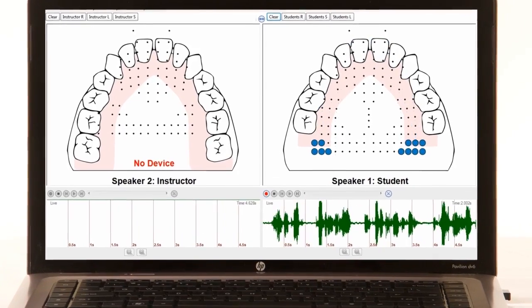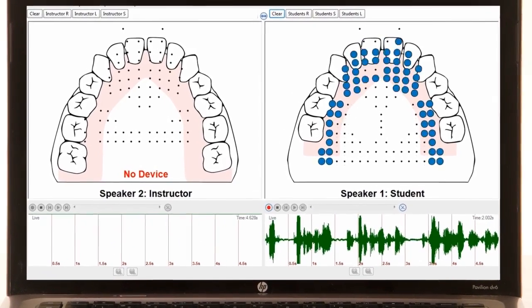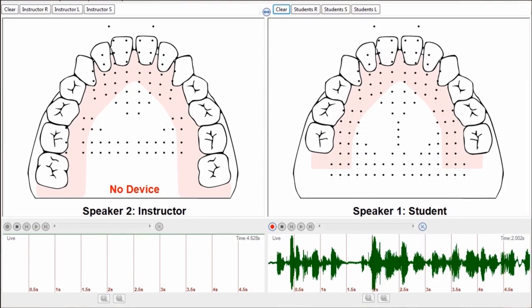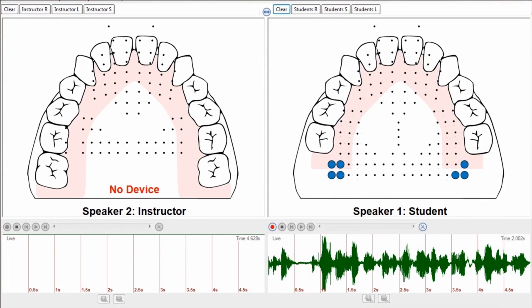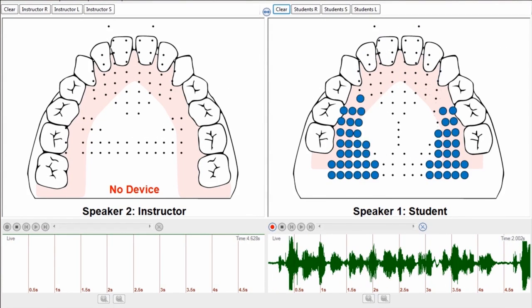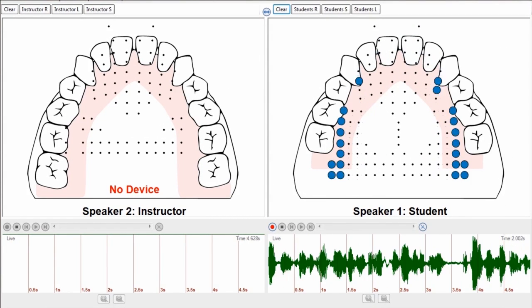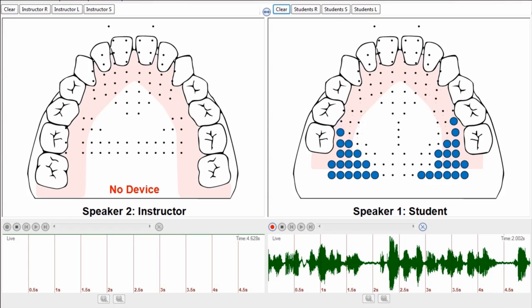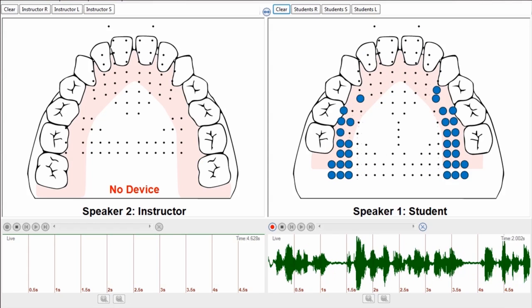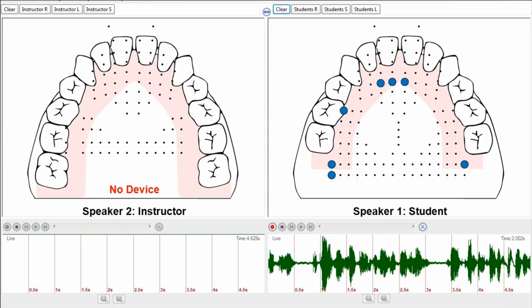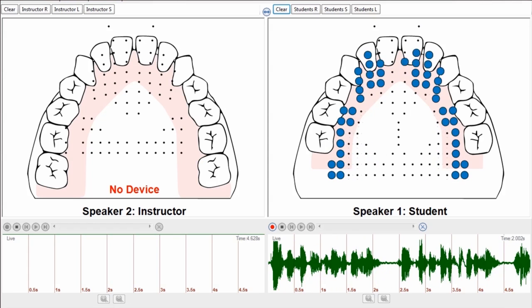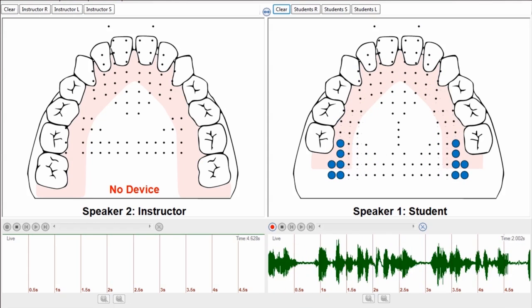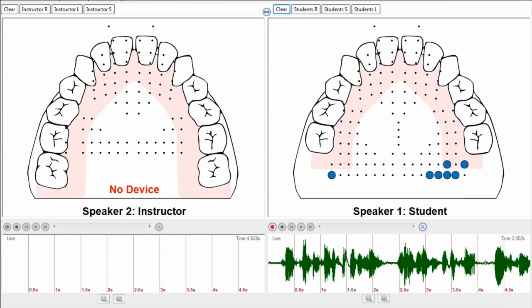The PaletteView software produces real-time visual feedback for all users to see. The PaletteView software was designed with you in mind. Create custom targets for every sound, save sessions for each client, and achieve your goals.